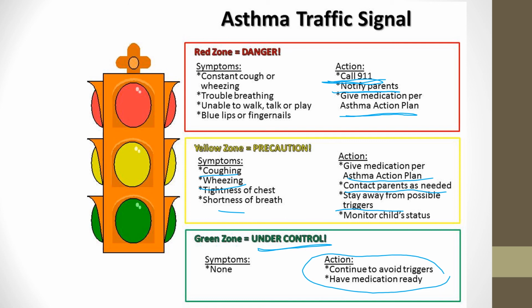So how do I know someone's zone? So 80% of what's predicted for them, their baseline, not of what's predicted for someone with healthy lungs, but for their baseline, 80% and above is going to be their green zone. 50% to 80% is going to be of their peak flow. We're talking their peak flow device, peak expiratory flow rate. They're 50% of their normal to 80% of their normal, or 79, I should say, percent of their normal is going to be their yellow zone. So if they blow when they get into their yellow zone, which is 50 to 79% of what their baseline is, this is when they're going to follow these action plans.